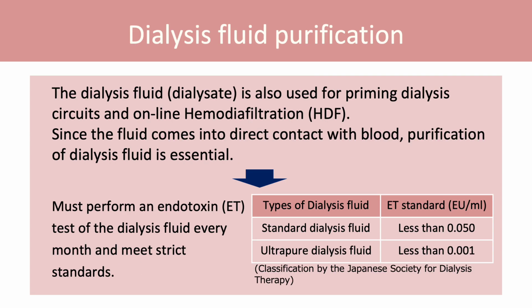Recently, dialysis fluid, or dialysate, is also used for priming dialysis circuits and online hemodiafiltration as well as diffusion. Since the dialysis fluid comes into direct contact with blood, purification of dialysis fluid is essential. Therefore, it is crucial to measure endotoxin in the dialysis fluid every month to ensure that the level of endotoxin is below the standard value.